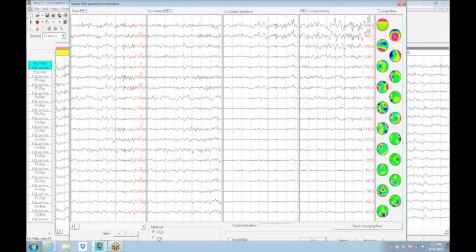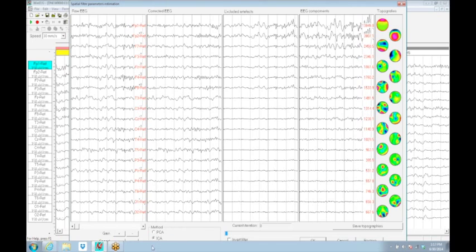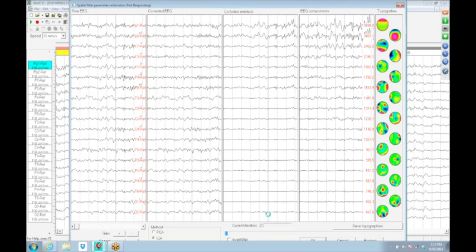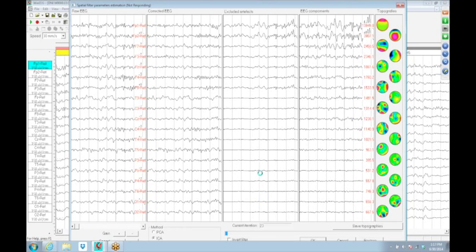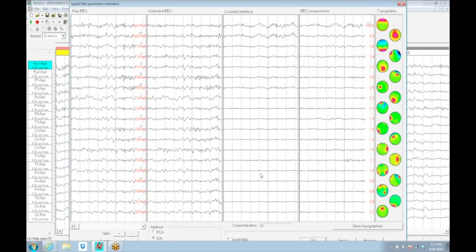This is a learning software. The learning software executes PCA, principal component analysis originally. The PCA you can see is not spatially distinct. The components aren't all easily identifiable as a spatially distinct generator. Some of these look like badly inoculated petri dishes with little islands all over them. By contrast, the independent component analysis can be done. The learning algorithm is going back through the EEG, going through a number of iterations, learning the raw spectra.